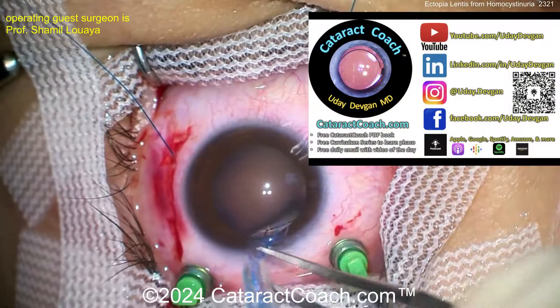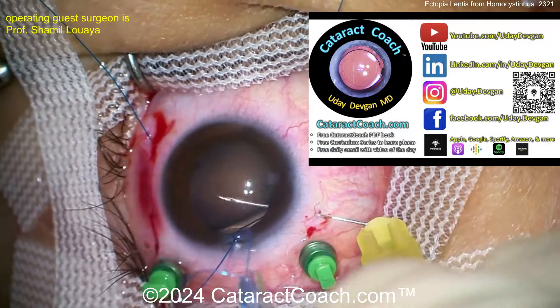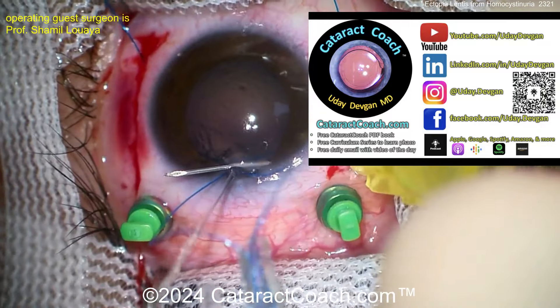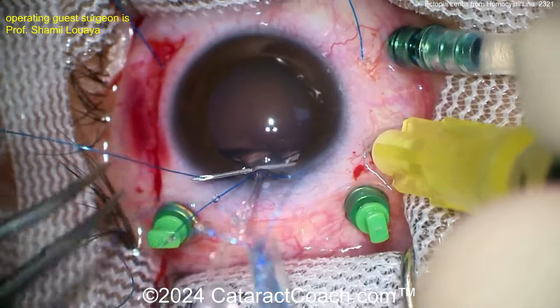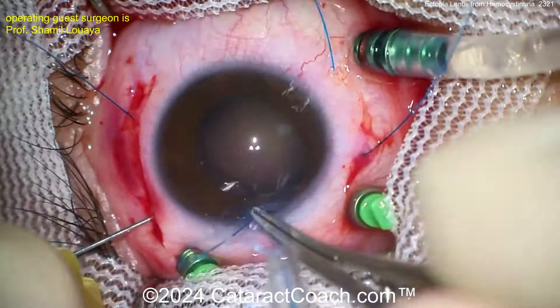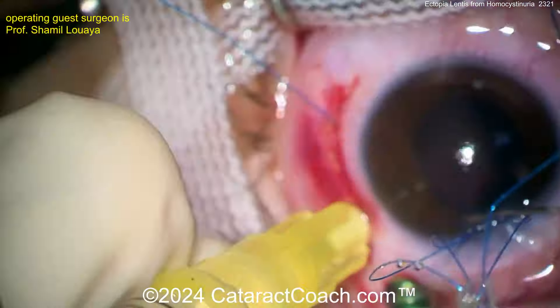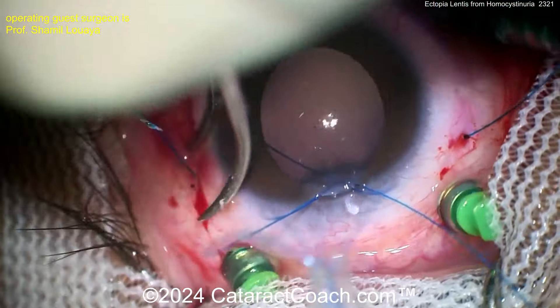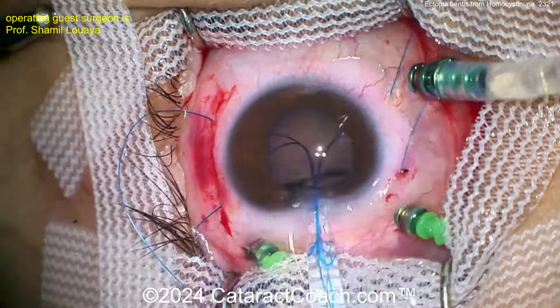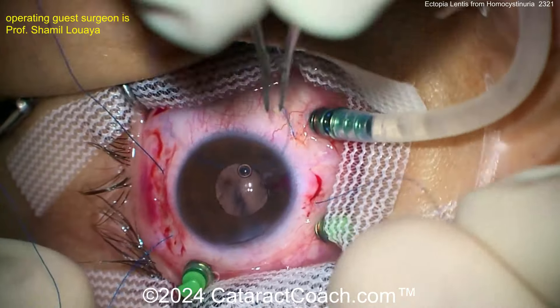The key in this whole surgery is keeping the spaghetti straight. Bringing out the third and fourth prolene suture ends — all four are being pulled out through the sclera. Now with all four ends out, it's time to insert the IOL. The patient had a full vitrectomy. The lens goes inside, pushed into the posterior chamber.